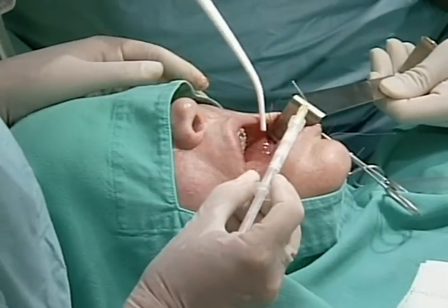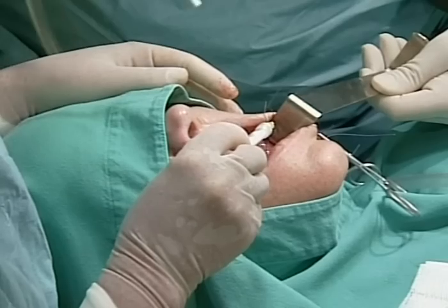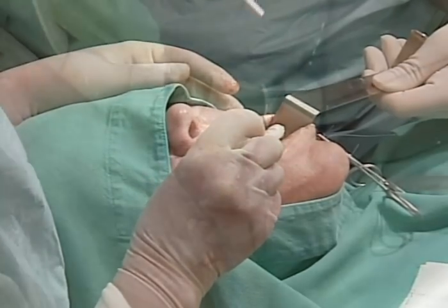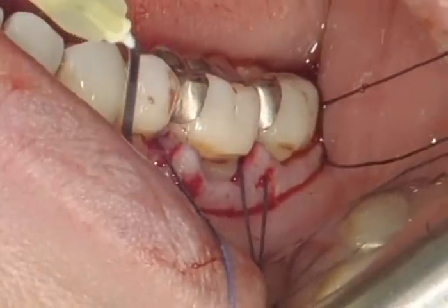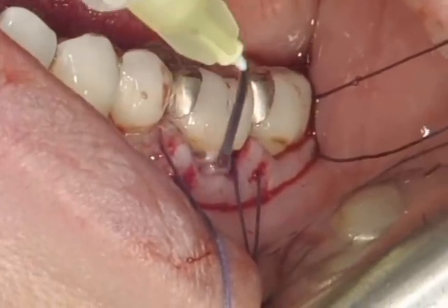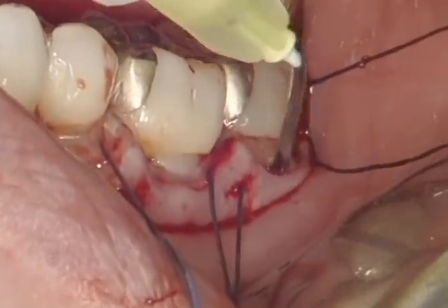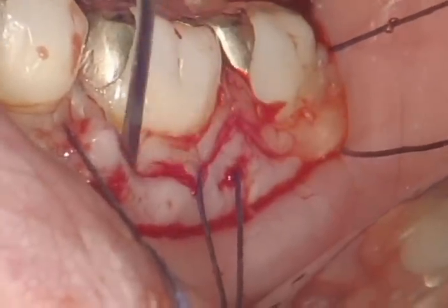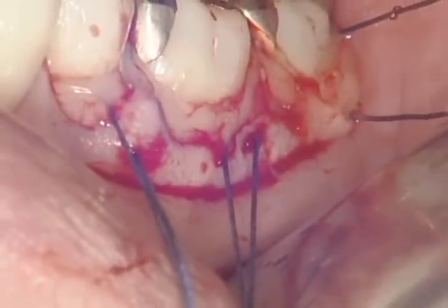PrefGel is applied now. The needle is inserted directly into the defect. The PrefGel is then left in the defect for 2 minutes to remove the smear layer by conditioning the root surface. Excess PrefGel flows out at the edge of the gingiva.